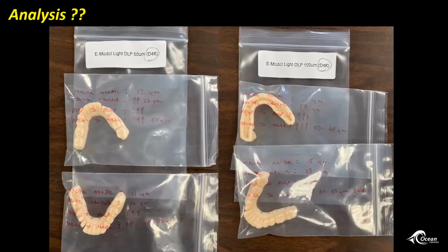So what I did was, I said, okay, this is a case that we did, 4 or 5 units, for Dr. Marangos in Toronto. Give us a wave, Dennis, if you're on, because I thought you registered. Anyhow, I took this file, and because it had lots of undercuts on it, and the toughest models to print for accuracy are ones with undercuts, contacts with undercuts, because it's hard to print into thin space, I did a test.